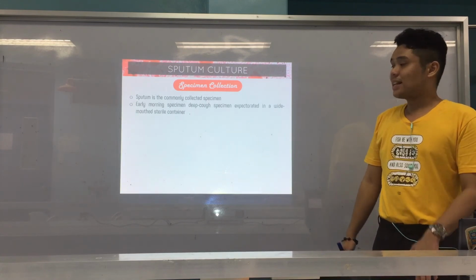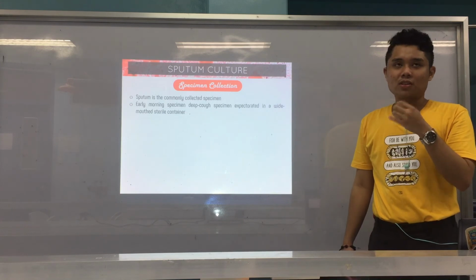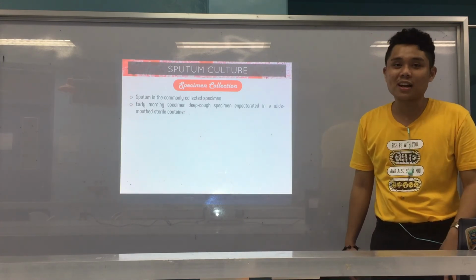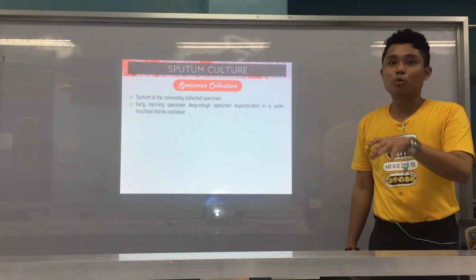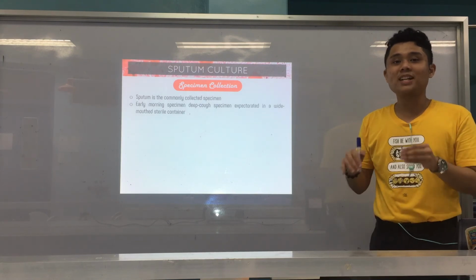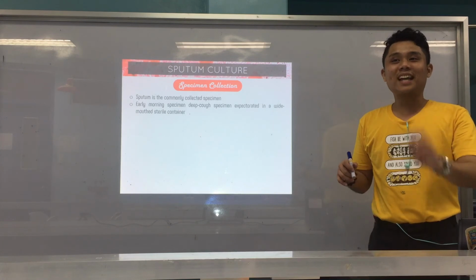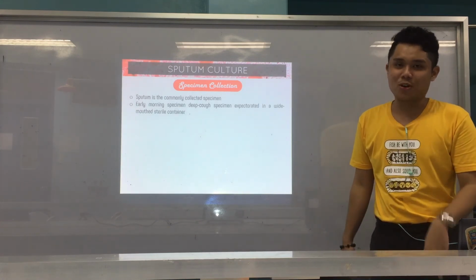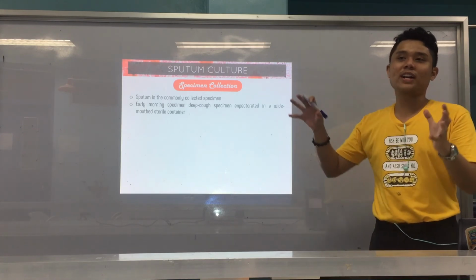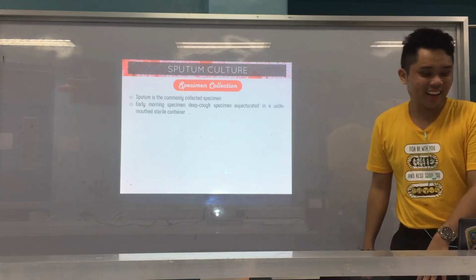Early morning specimen, it should be a deep cough. That is usually first for AFB. From my experience at SOTA, like 50, my God, in just one morning shift from 7 to 2 p.m., 50 to 100 patients, each patient with two sputum samples, that you stain for AFB and also culture. Oh my gosh, so many. Your whole morning shift, it's like you're being buried in sputum guys. That's my experience.